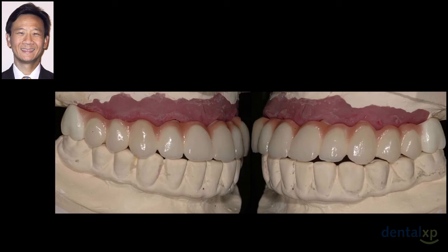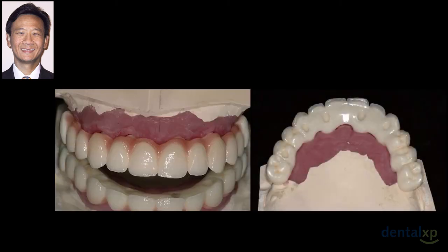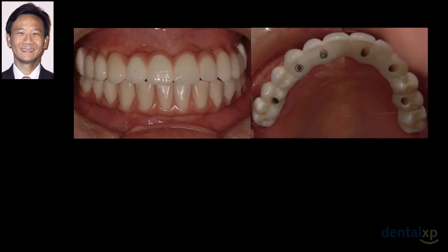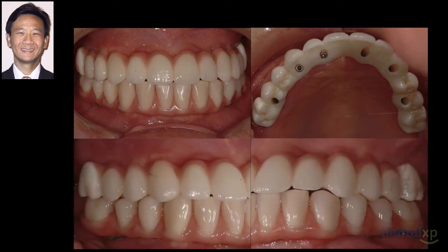This is the patient with the veneering porcelain placed, and you can see the solid zirconia molars. This is the occlusal surface with the thin veneering porcelain that was used for creating the aesthetics. And our prosthesis in place, an all zirconia maxillary prosthesis direct to the implants, and the metal and resin, or titanium and acrylic resin, fixed complete denture on the mandibular arch.